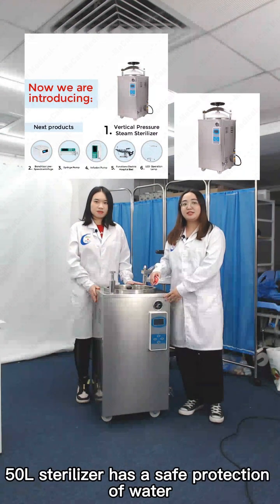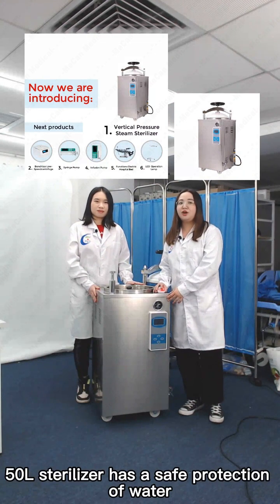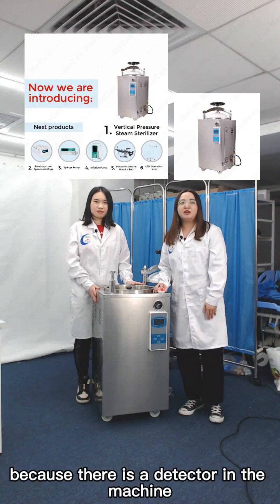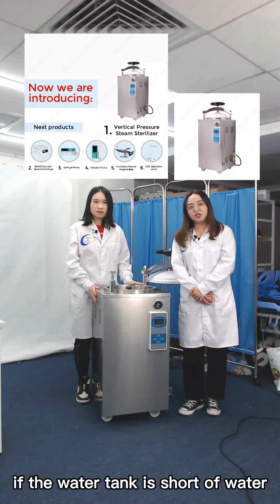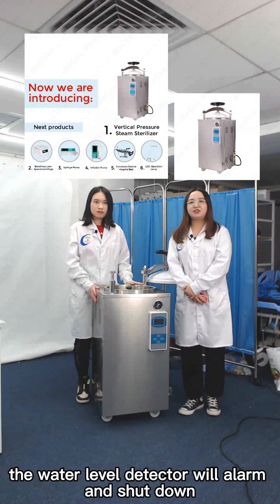This 50-liter sterilizer also has a water-lacking safety protection function. There is a detector in the machine — if the water tank is short of water, the water level detector will alarm and shut down.